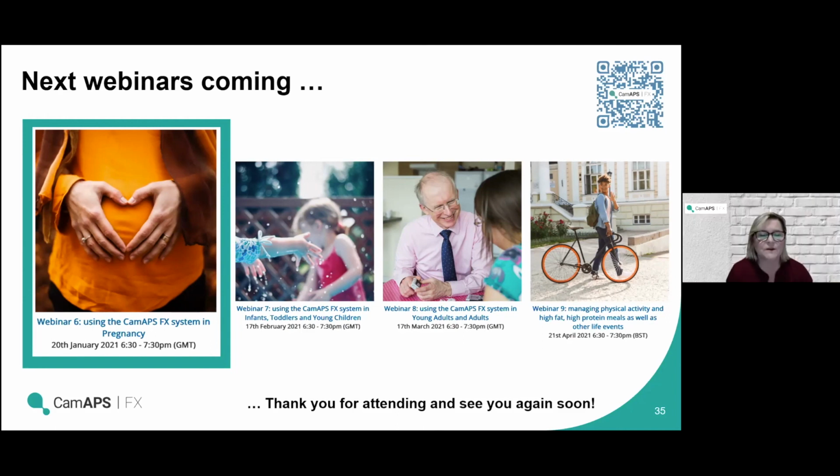Thank you. So there's a question about Diasend and putting in CGM manual readings to adjust the graph. This person's turned off those manual readings, but is it still reporting? Do you mean, so I'm presuming this means calibrations within the system? So you can see those on Diasend. You can select to not see them.